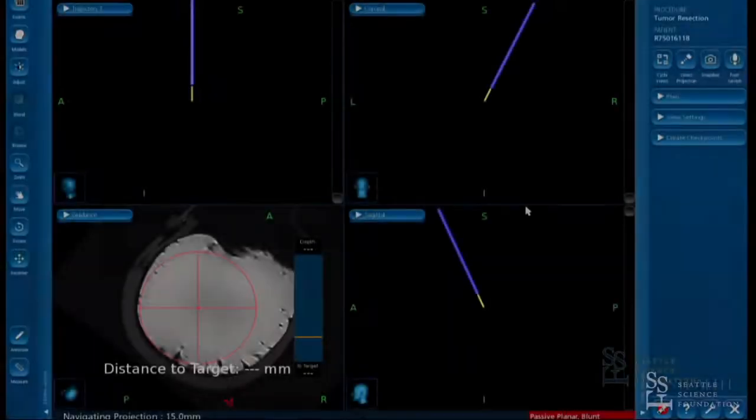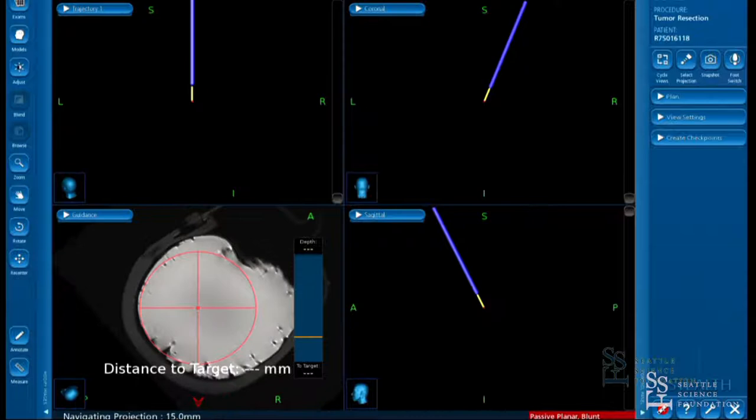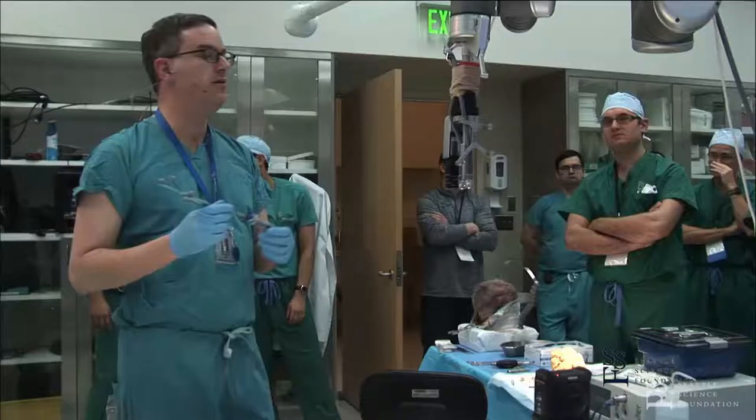The tip of your navigation wand is at the end of the trocar, which is the length of the tube — not at the very tip. The very tip of your trocar is going to project another 15 millimeters beyond. So you can ask your tech to add a projection 15 millimeters beyond and navigate that projection rather than the actual tip of your navigation.